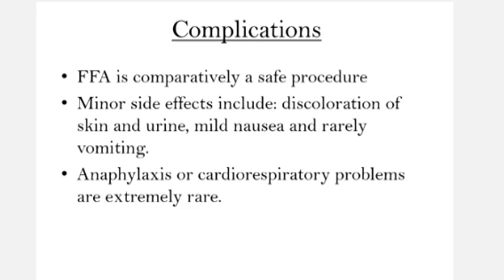These are complications due to the 5 ml of 10% sodium fluorescein we have injected, which causes the discoloration of skin and urine. Anaphylaxis or cardiorespiratory problems are extremely rare. These conditions happen very rarely.